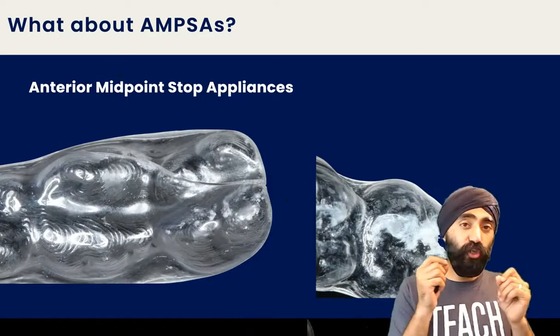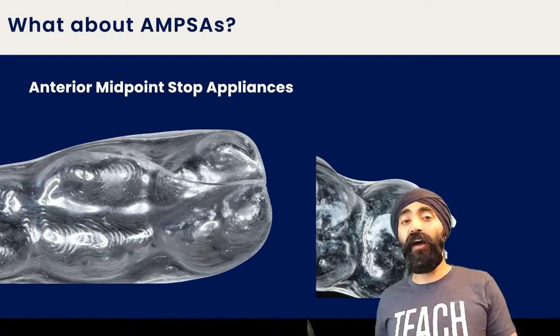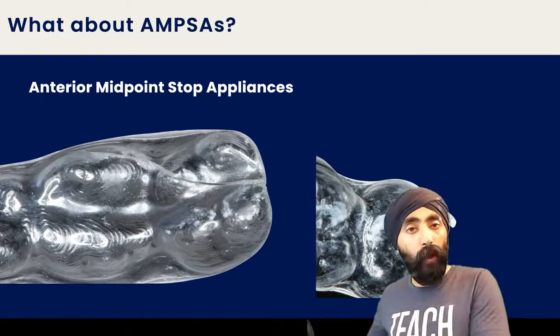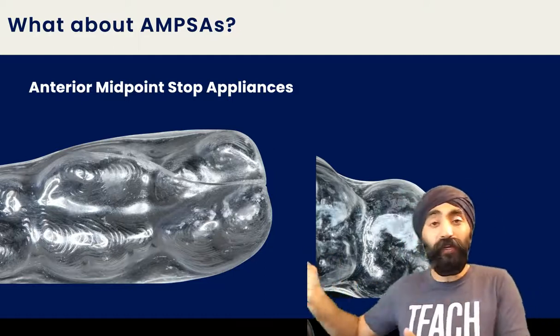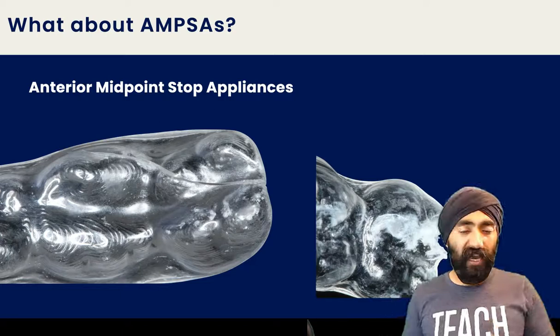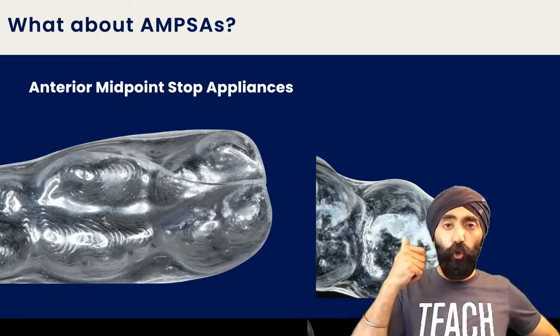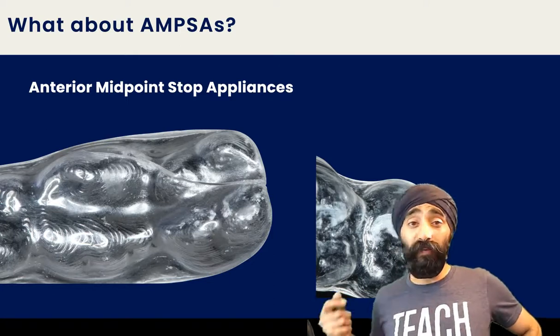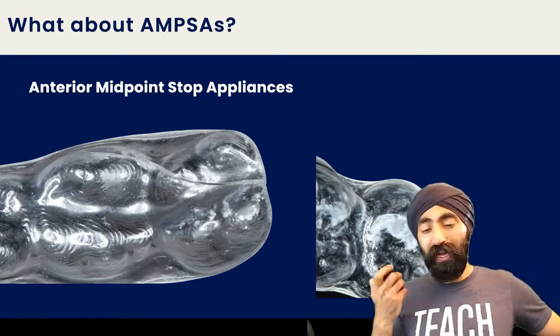What if they then start chewing their retainer very quickly and they're destroying the retainer? So then you're back to square one, right? Then it's like a soft splint again, right? There's no real difference. They're just destroying it. So this asymptomatic patient who's got large muscles, high forces, and they want to wear a splint, but they're destroying their splint, what could you now do?